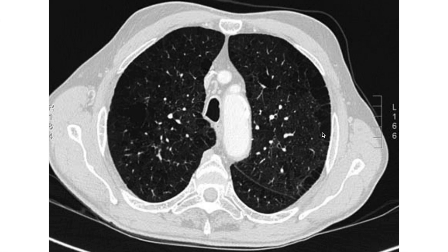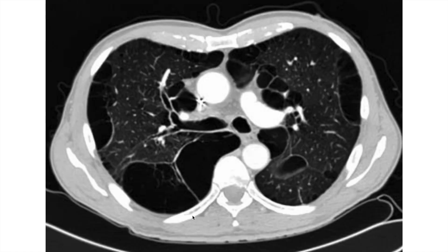This is paraseptal emphysema, as you can see here. This is a single layer of subpleural lucency, predominantly seen below the pleura, and this is called paraseptal emphysema. This is bullous emphysema — here you can see large cavitary-type lesions, called bullous emphysema.